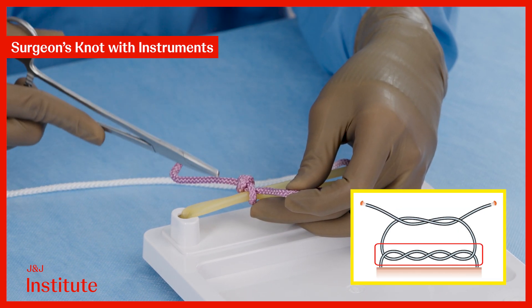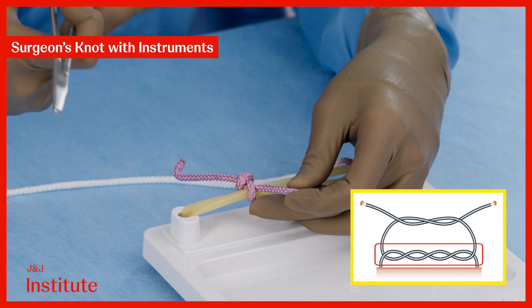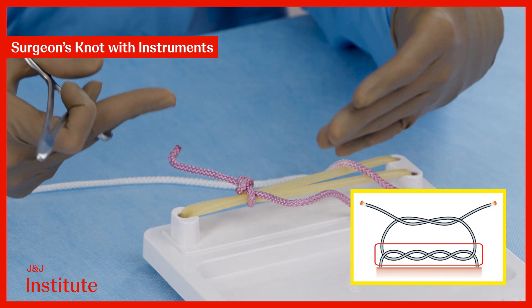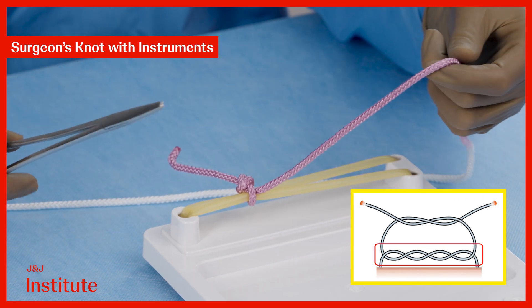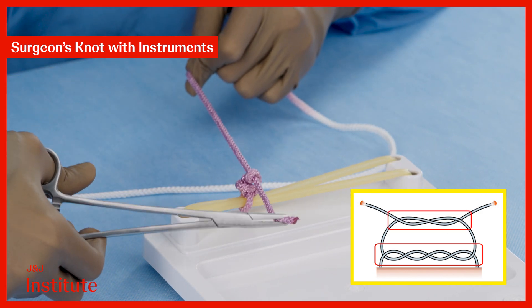What is the purpose of the two throws at the base layer? It increases the area of contact between the threads, increasing the friction, which reduces the risk of the threads unravelling while we are completing the second layer of the knot. I now add another throw on top as the third layer of the knot to complete the surgeon's knot.